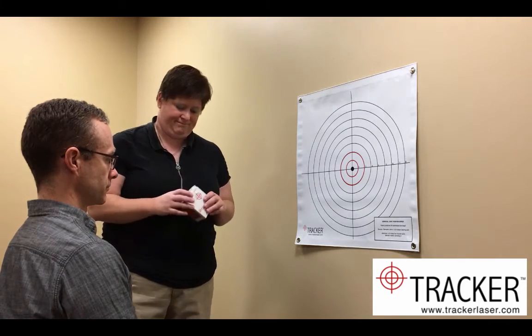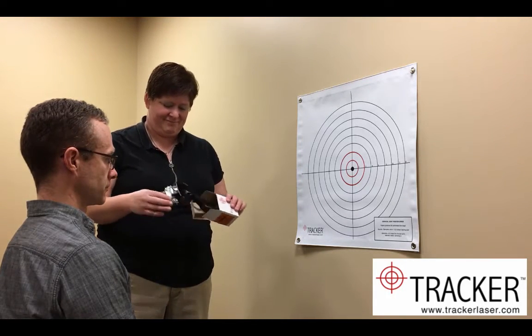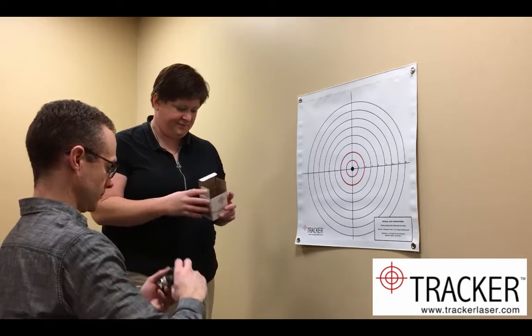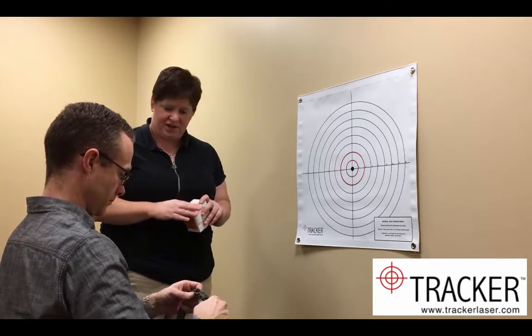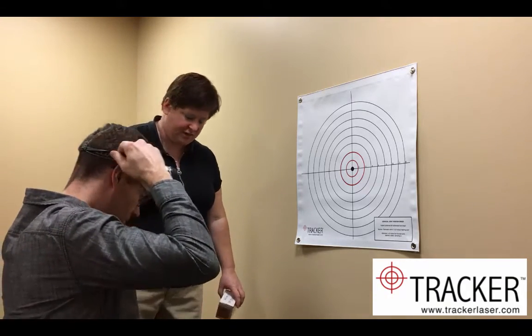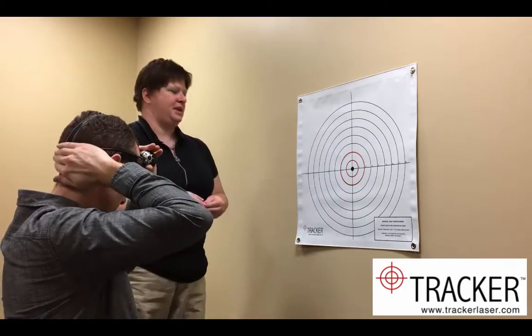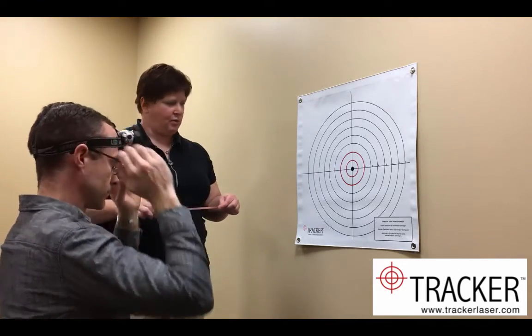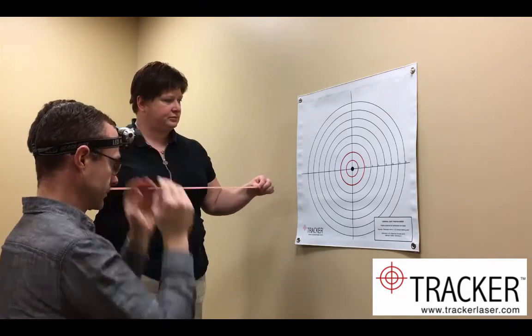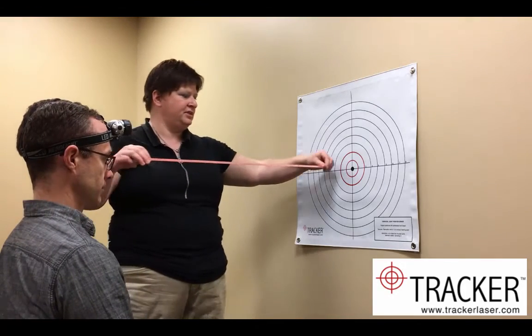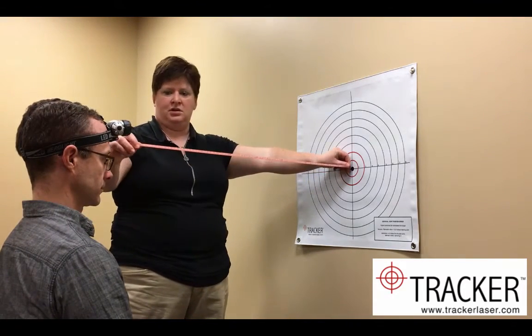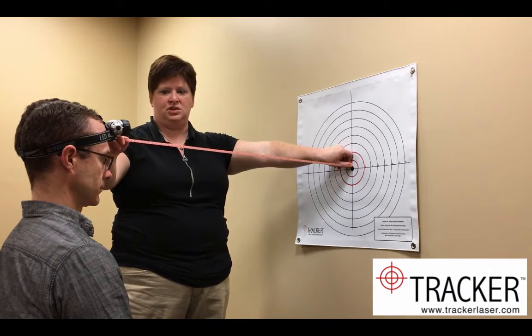Here's how you do it. Put that on. You want a patient seated comfortably in a chair about 90 centimeters away from your tracker bullseye. Measure from the bullseye to the laser.